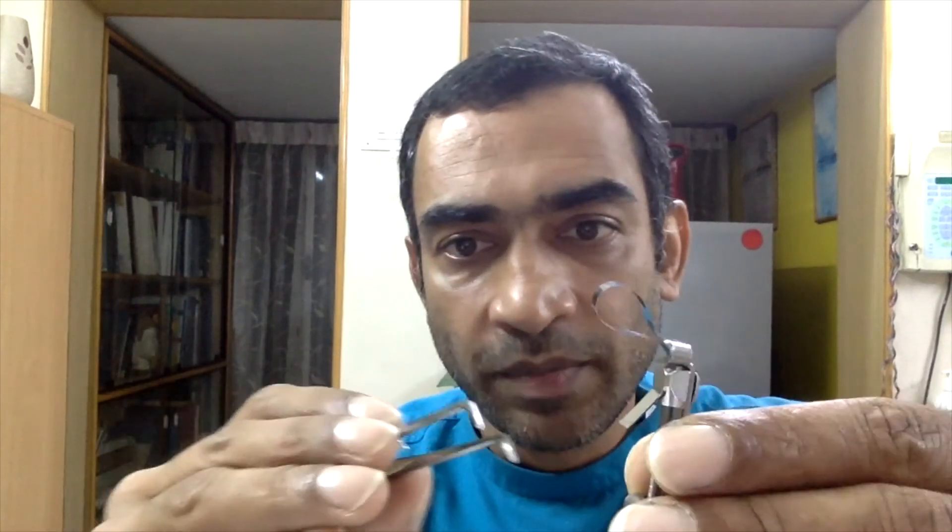Your next step is to tighten the small nut so the band is secured. You'll notice there is a free end of the band that could potentially damage the gingiva or cheek mucosa. So with the help of the tweezer, hold the ends and bend them inward — now this is a safe, smooth end that won't hurt anybody, and the pointy bits are safely tucked inside.